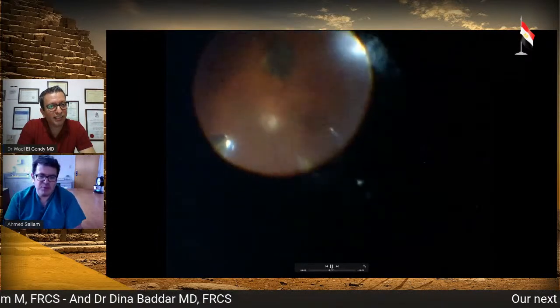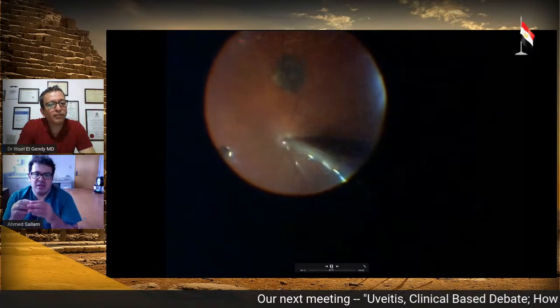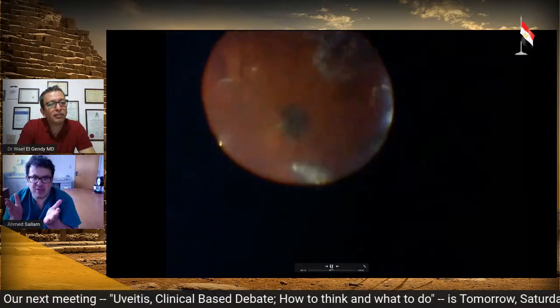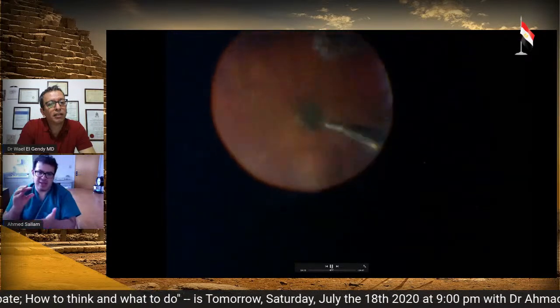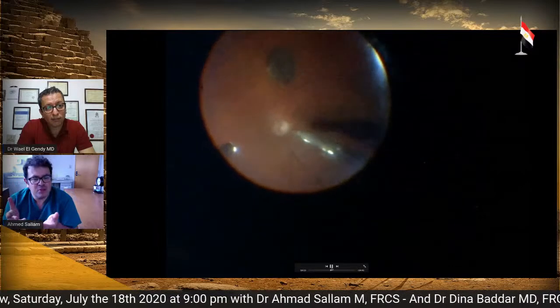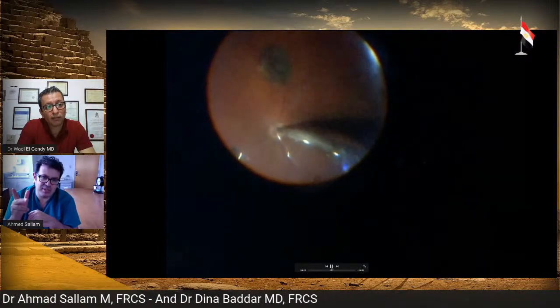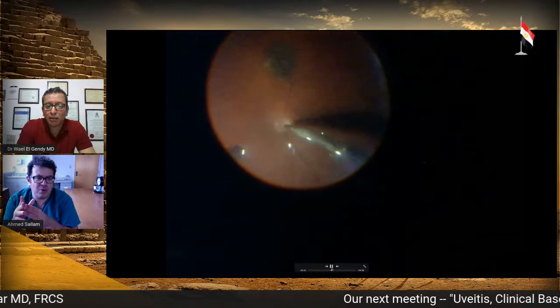So I have a few tips here. One tip is the last bubble. There's a worry that because the pressure is high from injecting the silicone oil, if you continue to inject to get the last bubble, then you will get the last bubble and the retina even can jump to your backflush. So one tip is the very last bubble, stop injecting the oil and press on the sclera with a finger. That's actually usually more controllable.